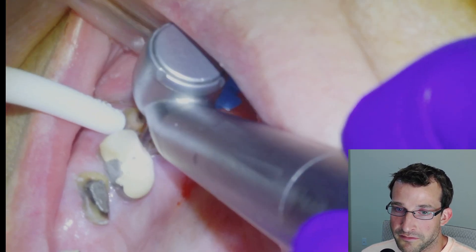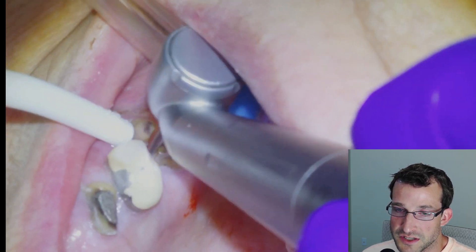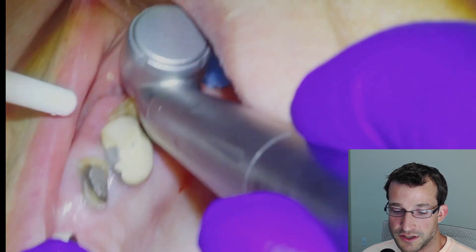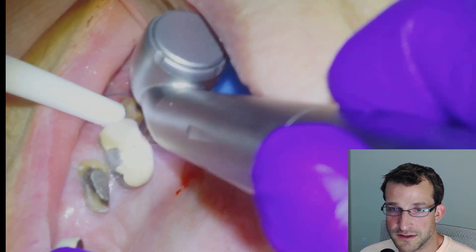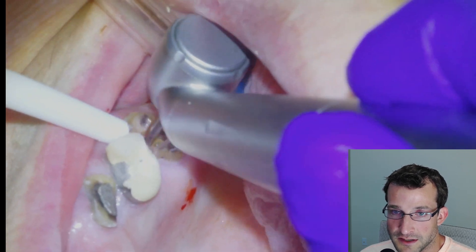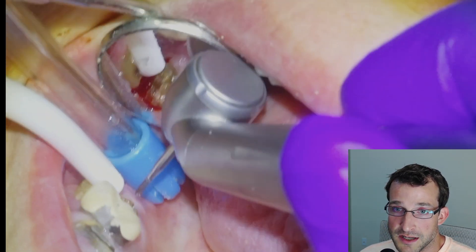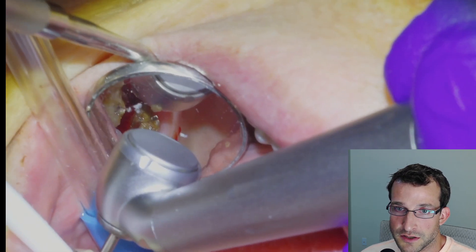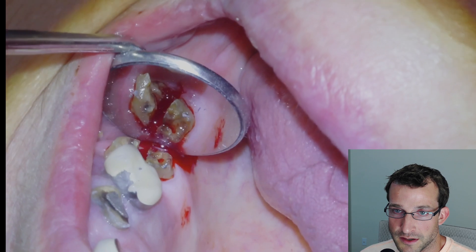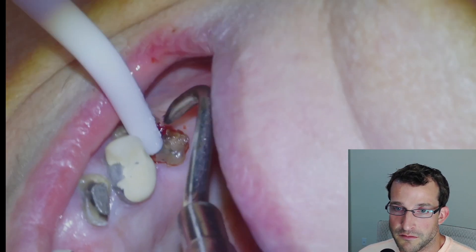We're going to take our trough pretty deep so that when we put our root tip pick or elevator in, we can really get some good leverage and luxation of the two sections. We'll finish separating all of the dentin that's connecting the sections, take our trough pretty deep, and that's looking pretty much good to go there. Fast forward until we get our root tip pick.